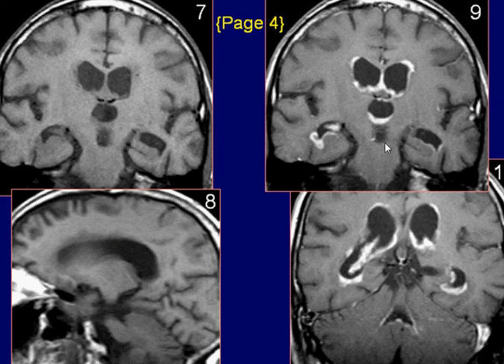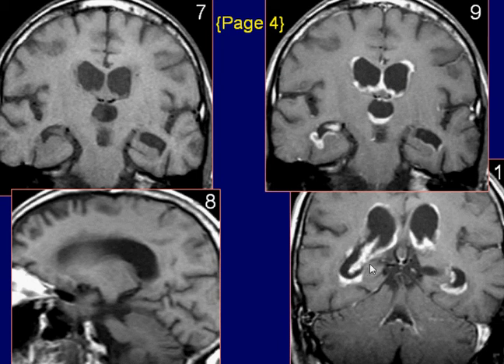Coronal post-GAD T1-weighted images demonstrate extensive nodular ependymal enhancement in the lateral as well as third and fourth ventricles.